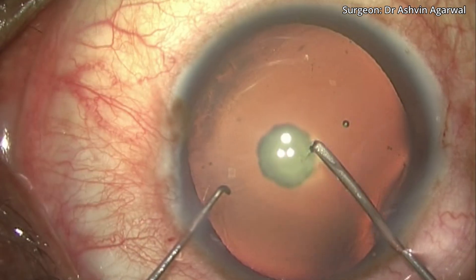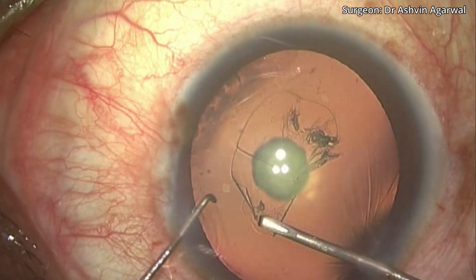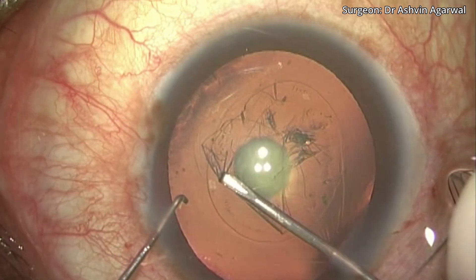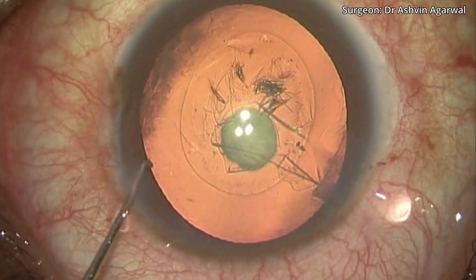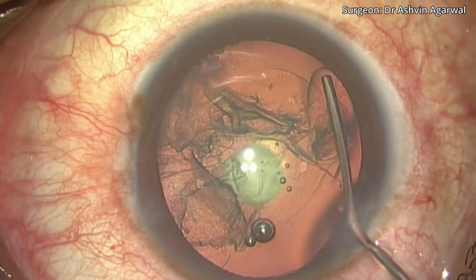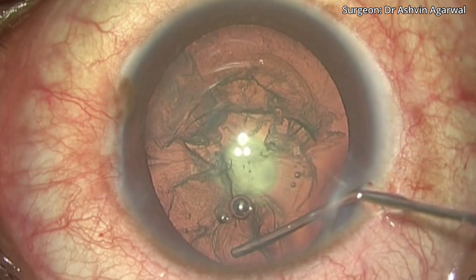Make a 5 to 5.5 mm rhexis, which is important to facilitate placement of the IOL in the sulcus in case of a posterior capsular rupture. Once an adequately sized rhexis is made, visco pockets are created all around the nucleus.